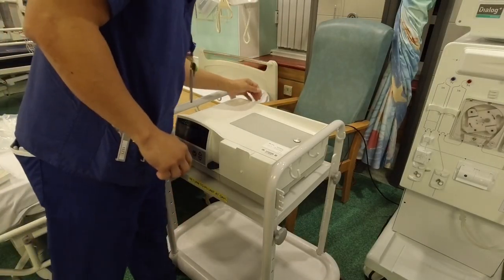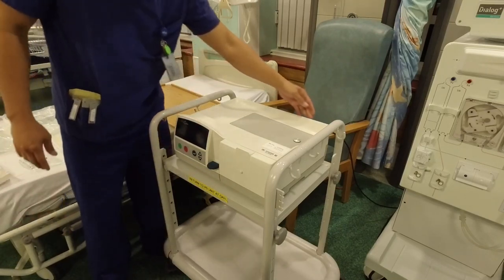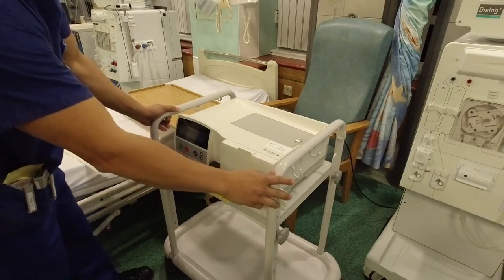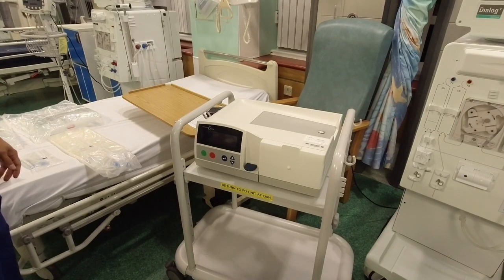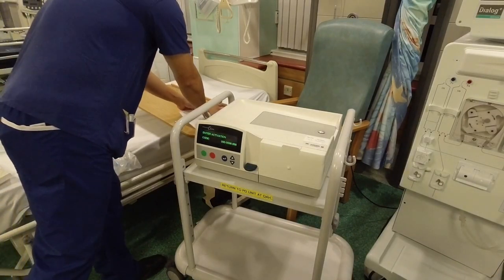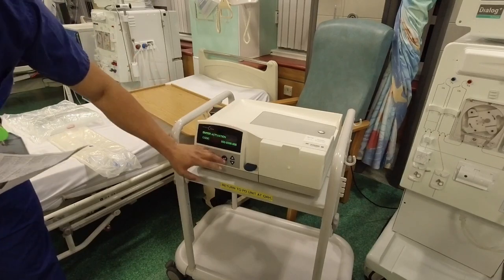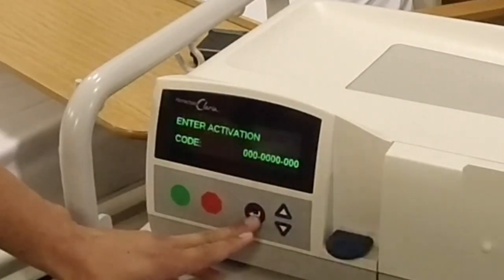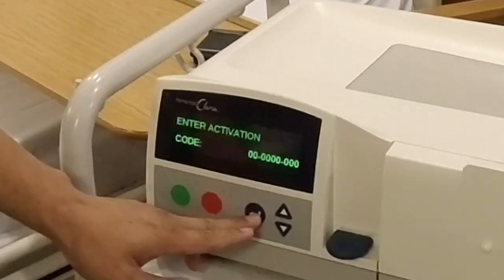First thing we need to do is connect all the sockets for the internet and the machine. Turn the machine on. It says please wait. Enter activation code. This is a patient-specific code. Press the bent arrow key, then enter the number 0, and then enter 0 for the next one.